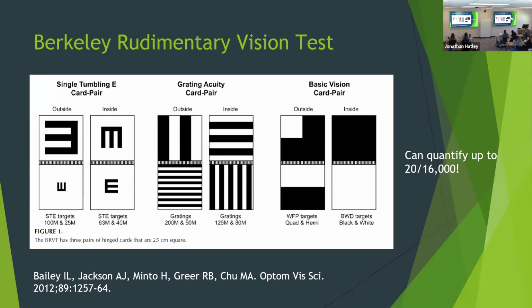Most of the time, what they're used for is not in day-to-day low vision clinics, but things like trying to identify if someone has any vision at all whatsoever. Research. Also, they've used them in Special Olympics or Olympics competitions where you're pairing up visually impaired individuals against each other so that hopefully we can level the playing field in terms of vision.